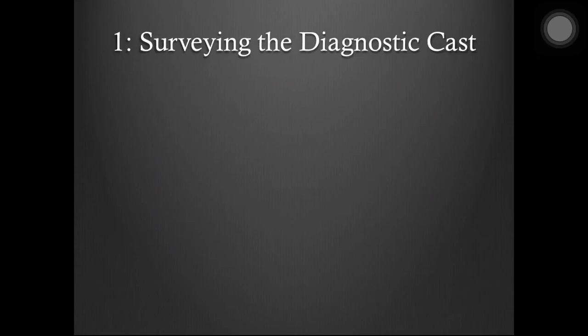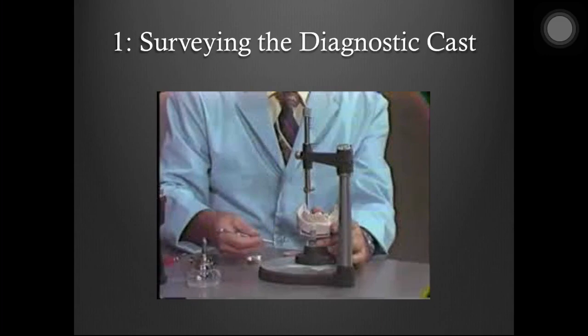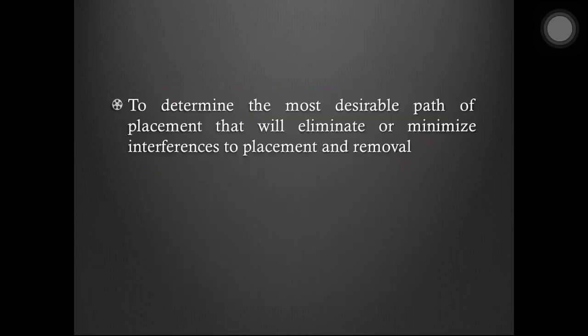The diagnostic cast is the cast taken at the initial appointment of the patient, when the patient reports to you and wants his or her treatment. You record his or her impressions, and that is called the diagnostic cast. Surveying the diagnostic cast whenever planning for a cast partial denture is mandatory.